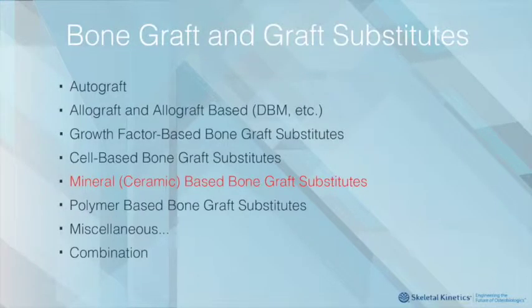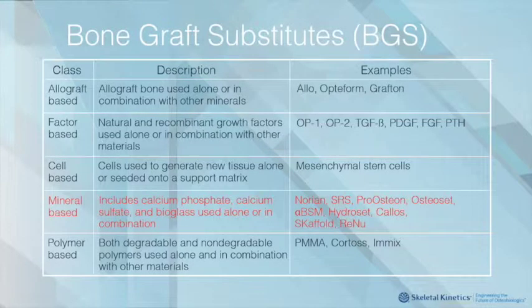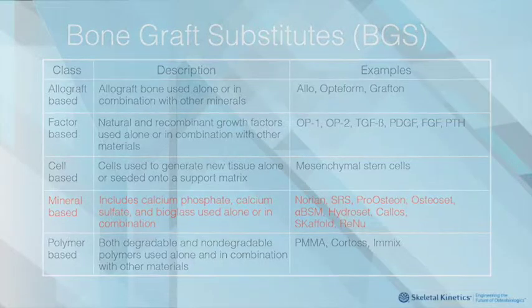This particular slide shows bone graft and graft substitutes. SKaffold is a mineral or ceramic-based bone graft substitute. The category of bone graft substitutes is comprised of calcium-based products. A few of these products include calcium phosphate, calcium sulfate, bioglass, and several others.